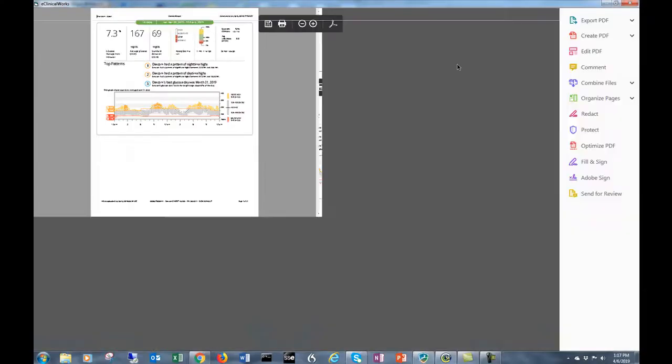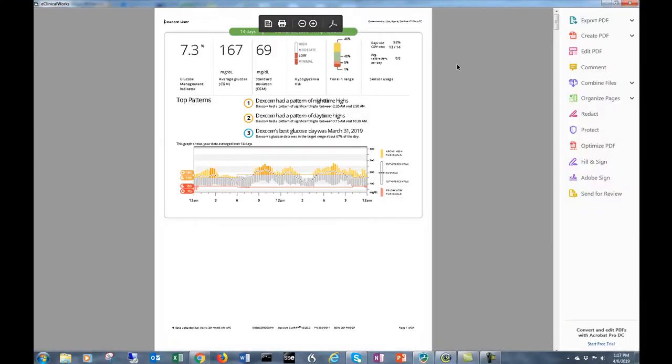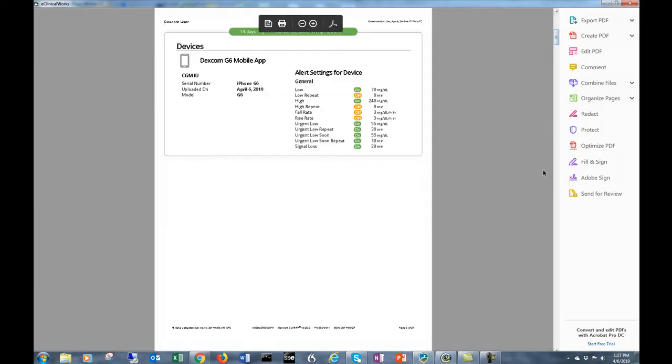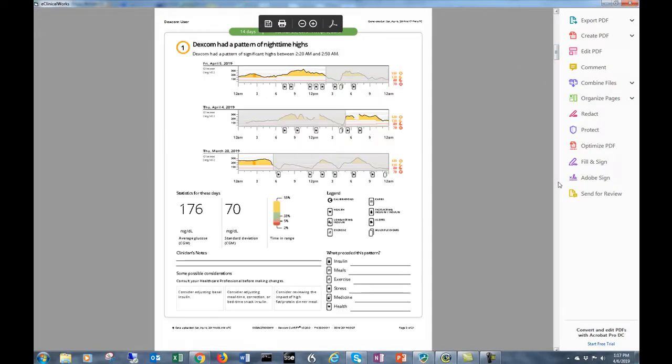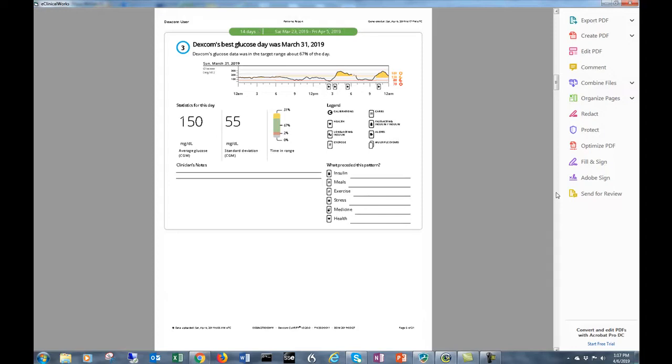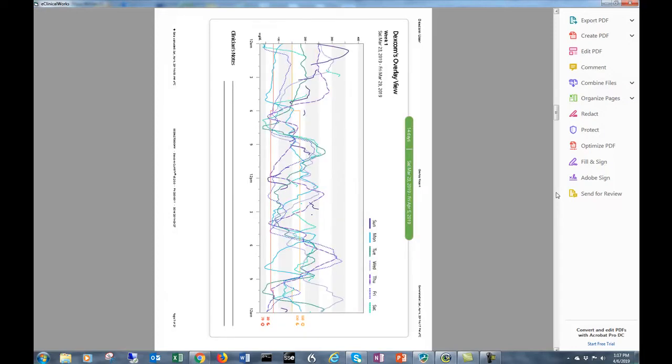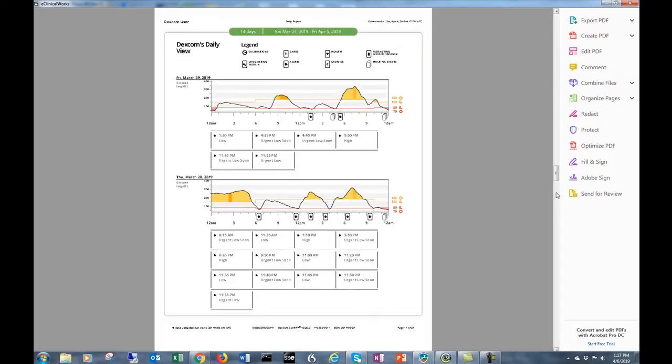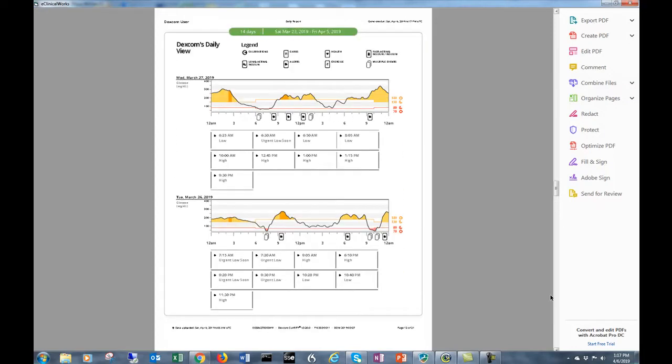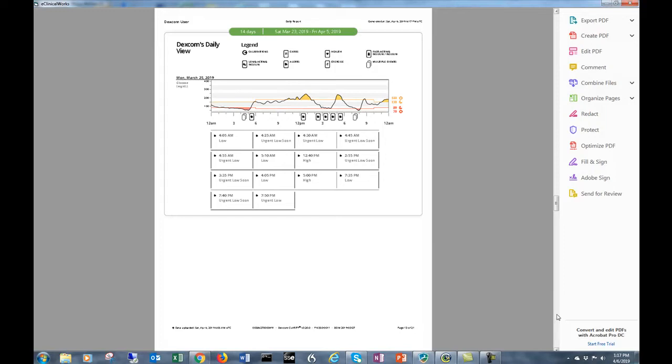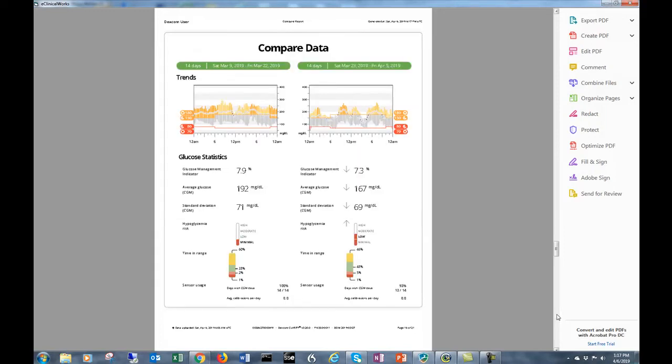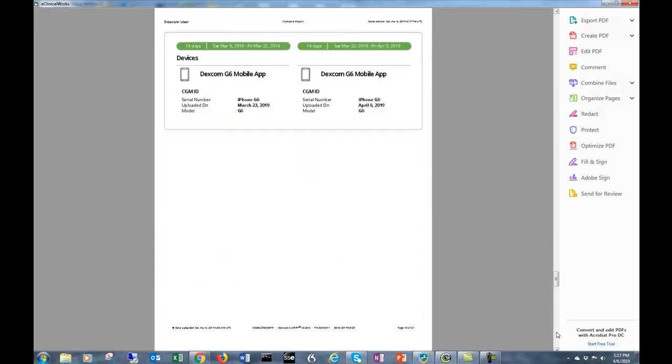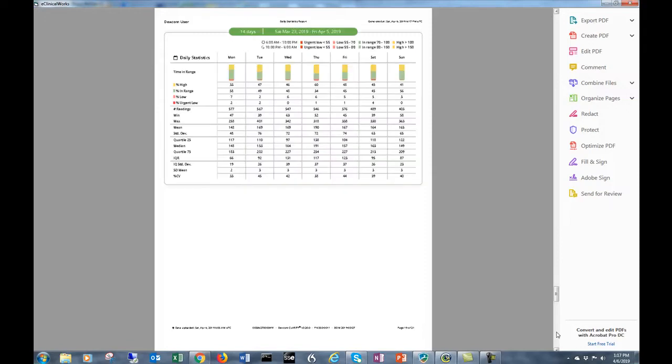This is the complete Dexcom clarity report. It includes the glucose management indicator, which is a new feature of Dexcom. You can see each day's report for the last two weeks and the glucose levels in a modal day report and the Dexcom AGP report.